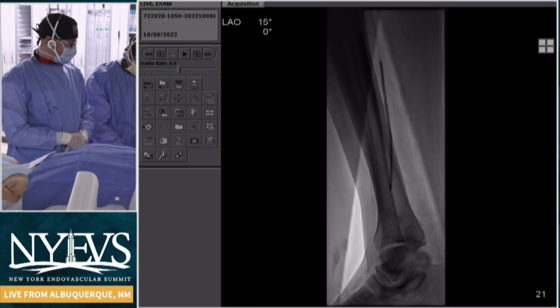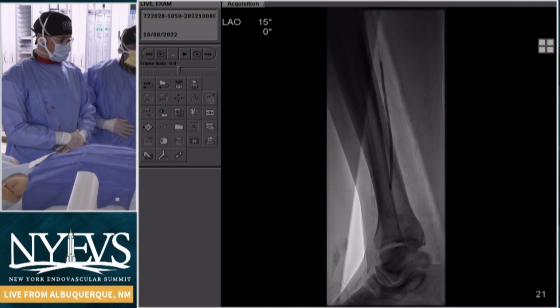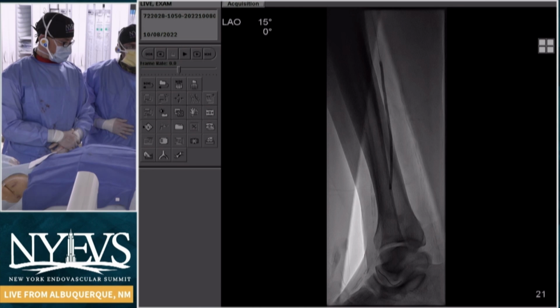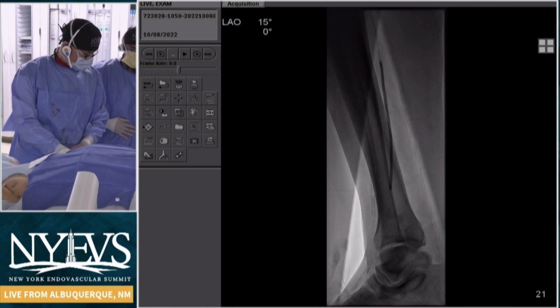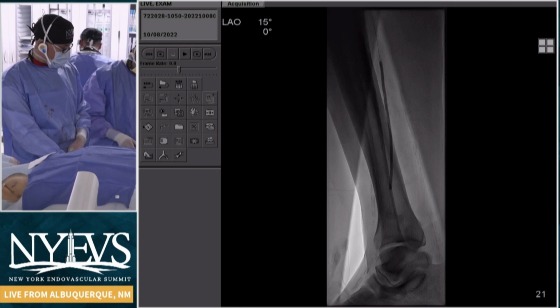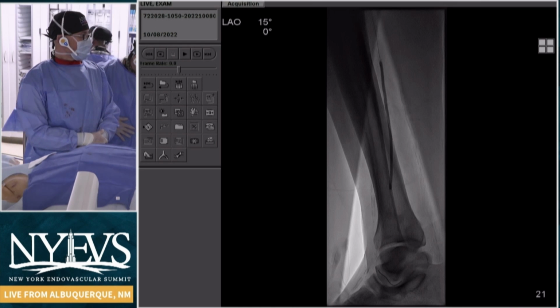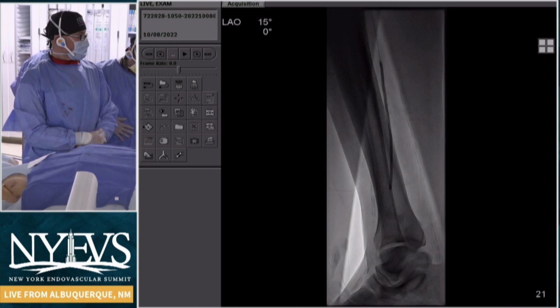Yes. It could be useful to understand when to stop, because the problem in these patients is not only what to do, but also if you achieve a nice result, whether it can be sufficient to heal the ulcer. Yeah, I think the perfusion imaging is correlated a little bit better for those of us that do stroke interventions in terms of the brain, but in terms of limbs, we don't have a good idea of what it tells us and what it means. I think that's the hard part.